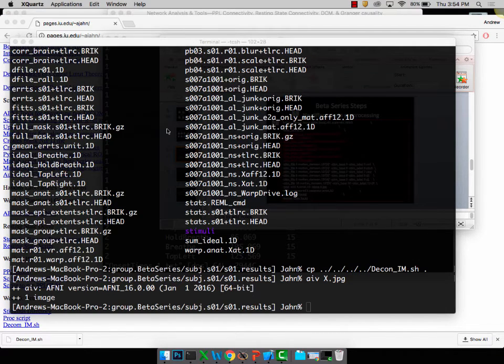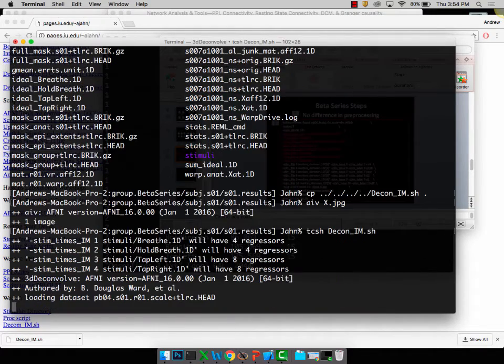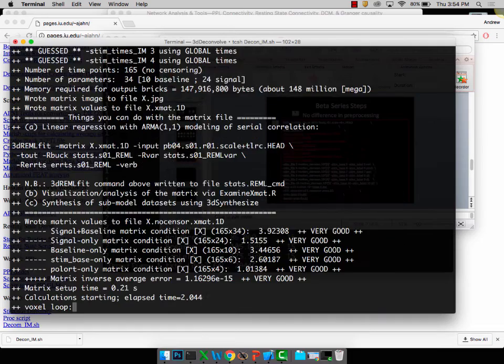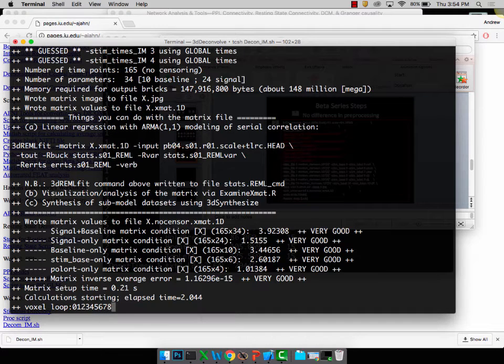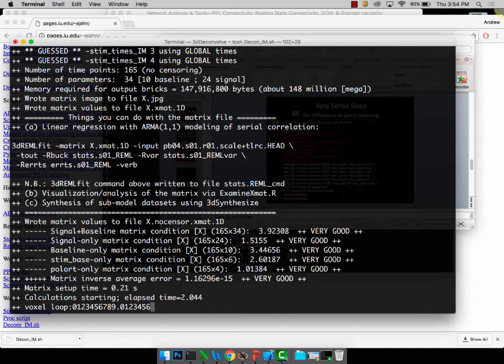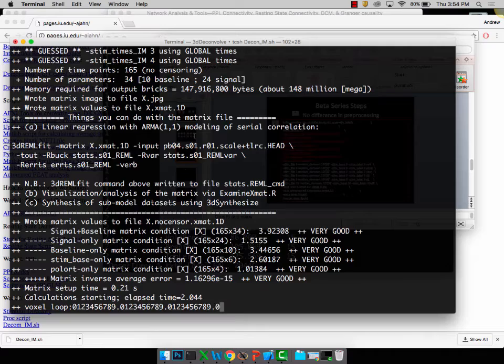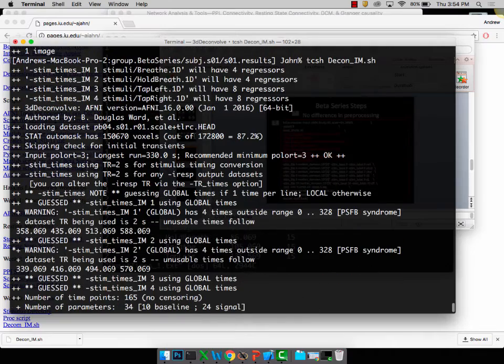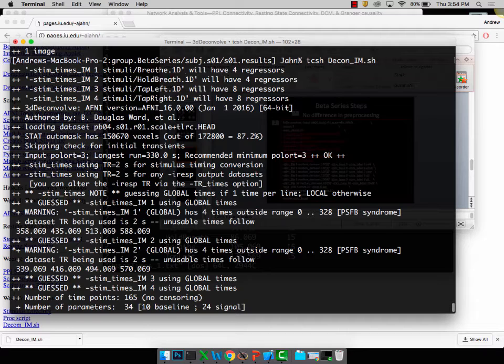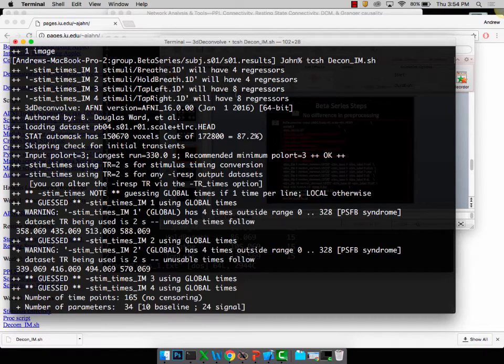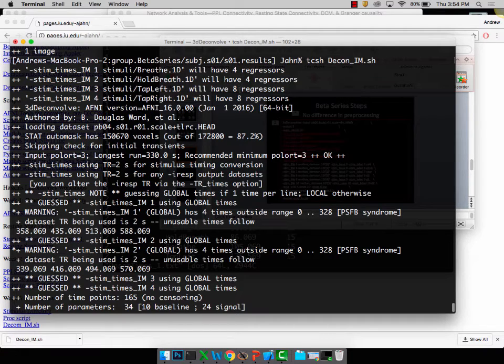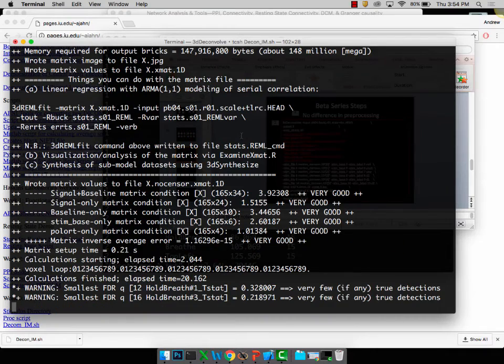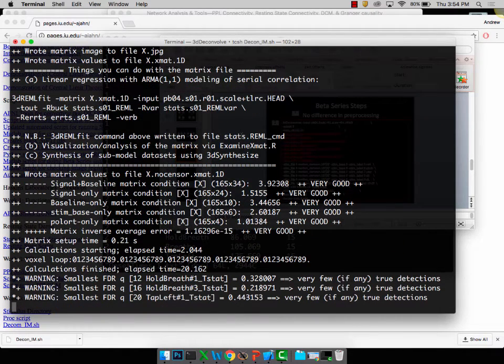If you go ahead and run the decon underscore im, this will just take a few seconds. While that's running, notice that at the very beginning it said this regressor right here is actually going to have four regressors. This one's going to have four. Next one's going to have eight. So if you actually look at those timing files, this first one would have four timings, then four timings, then eight timings, eight timings. You'll see that reflected in the design matrix once this is done.